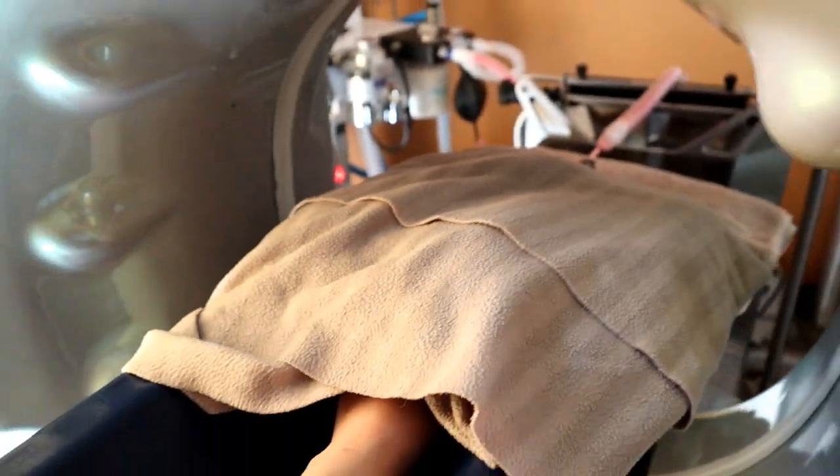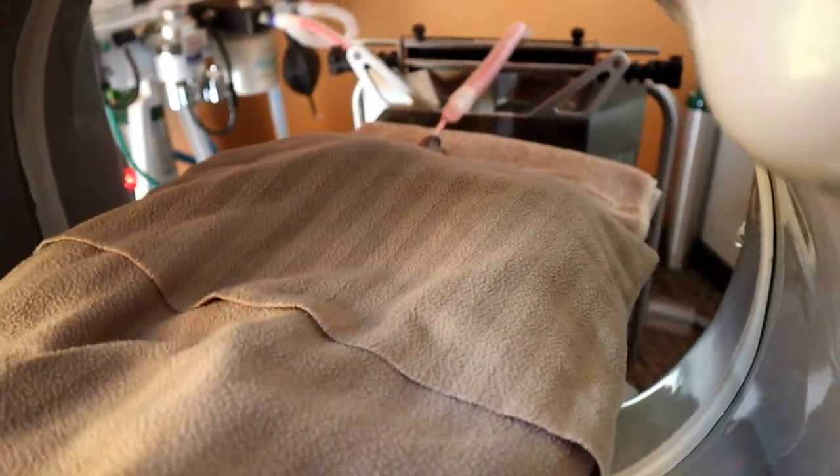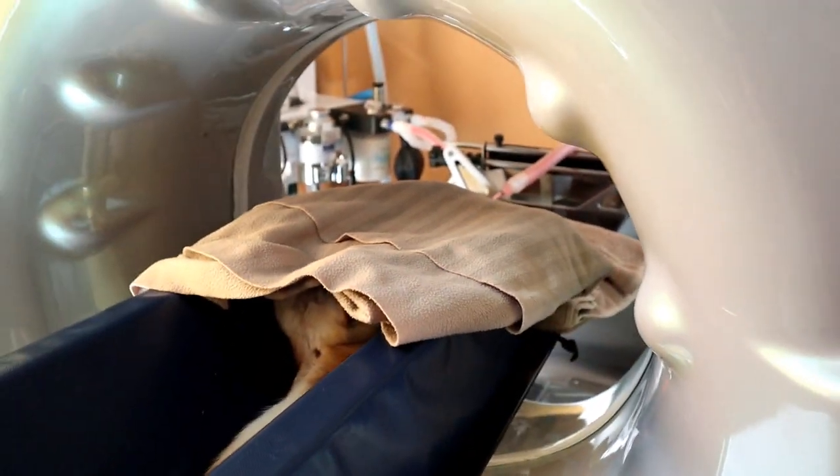In situations like this, it's always a good idea to try to get a femoral pulse, just because during the scan she can't move and you can't be moving your stethoscope in and out of there. So from here I can both feel her heart rate on her femoral pulse as well as feeling her respirate, so she is constantly being checked out.